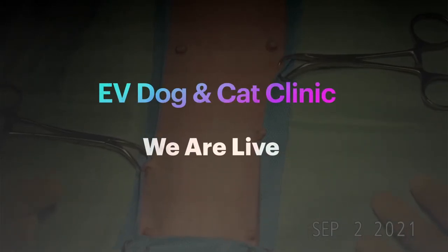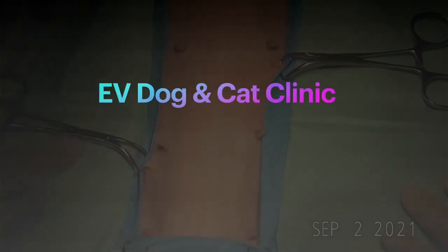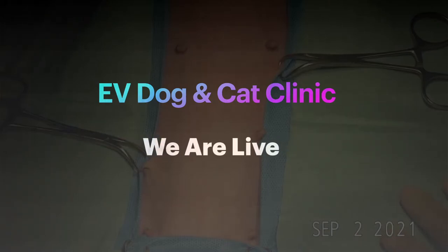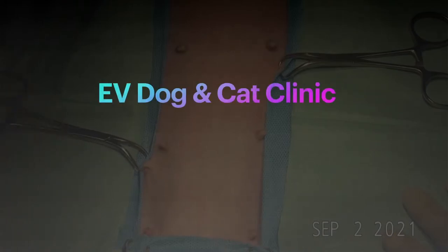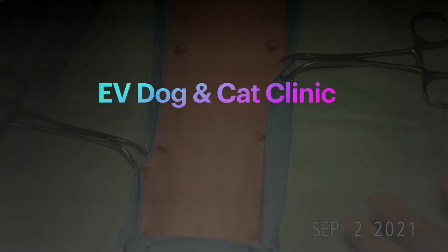This dog was reported by the owner to have just ingested a sewing needle. But the owner is not sure if the needle has a thread with it. And the radiograph showed that the needle is in the caudal abdomen region already, maybe in the colon, hopefully.